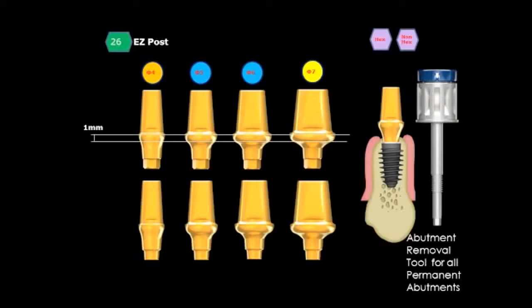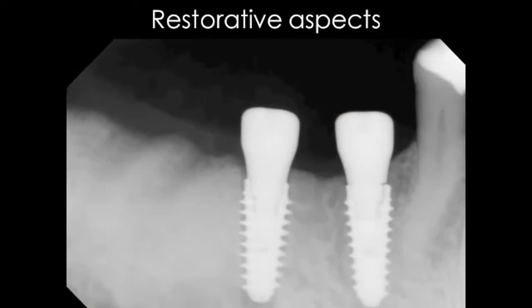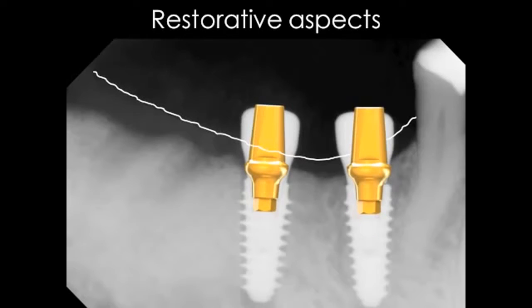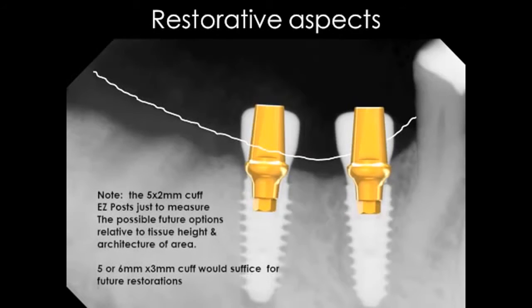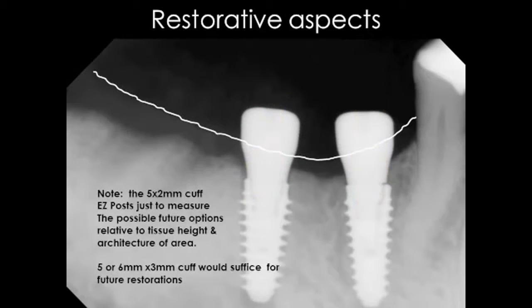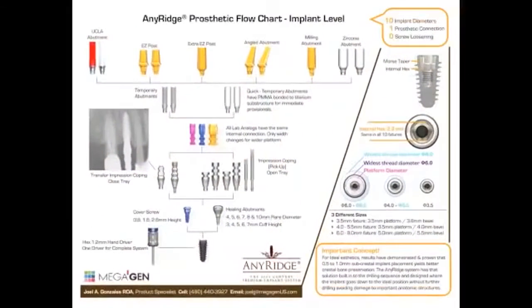Anything that's final as far as the abutment goes utilizes that abutment retrieval tool that you saw in there, and you will use that to remove any final abutment as that 5-degree Morse taper truly grabs that abutment into place. Note the different prosthetic options that you see. Just as a little measuring device, you can see there was a 5 flare. Now that's a 6 flare. Note the different emergence profiles you can deal with.